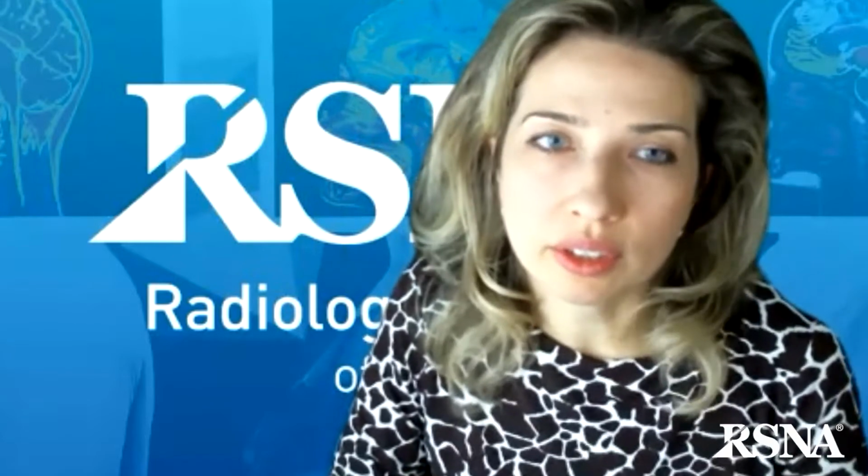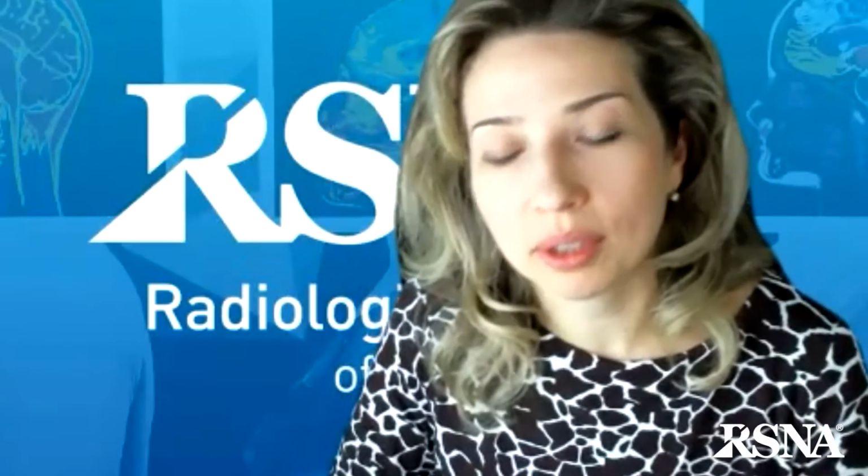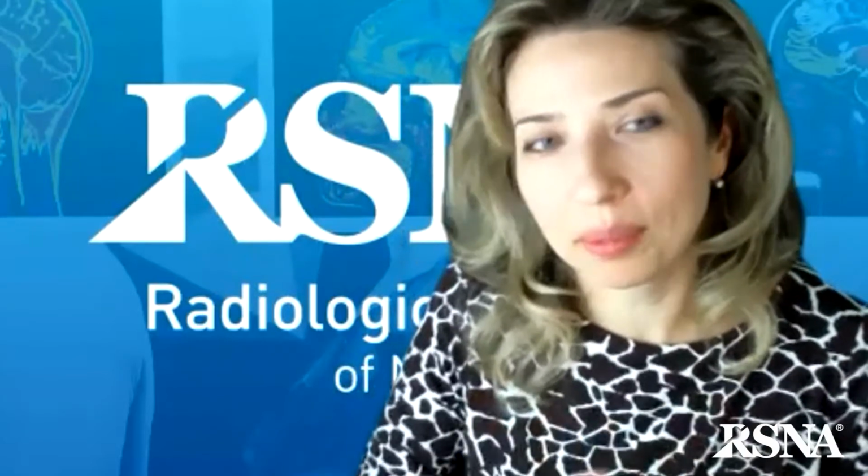The pitfalls, I would divide in two categories. One is the technical pitfalls and difficulties, and the second one is interpretational pitfalls. On the technical side, it's all about optimizing your MRI imaging. And for some patient populations who have difficulties tolerating MRI, the best MRI sequence is ultrasound. So you have to choose patients, how you're going to image them and what exactly you're going to image. But if you settle on MRI, there are several strategies to optimize.